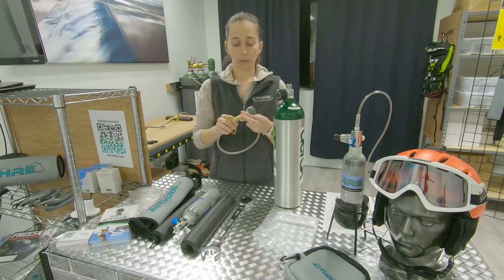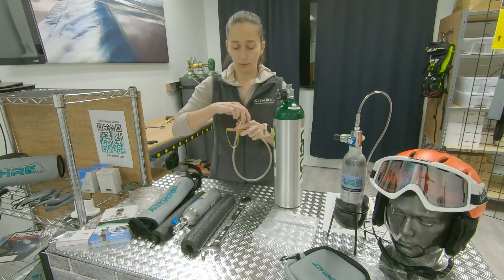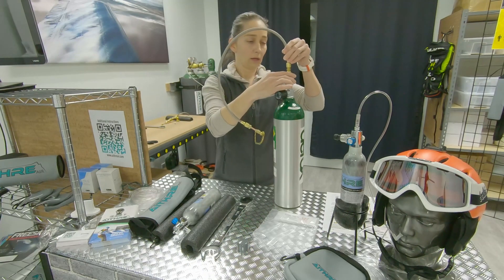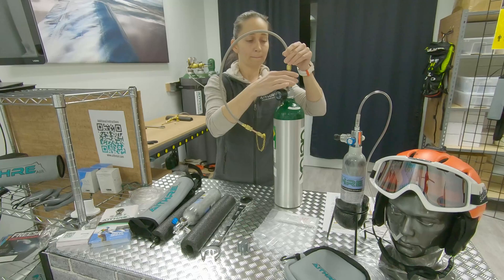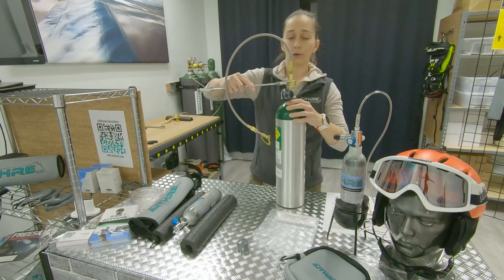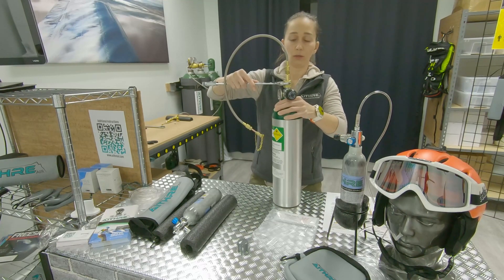This transfilling hose comes with caps on each end so that you can keep dust and debris out. We'll take that cap off and screw the hose on. You want to hand tighten as much as you can and then go a couple of turns with a wrench — one and two, that's about it.